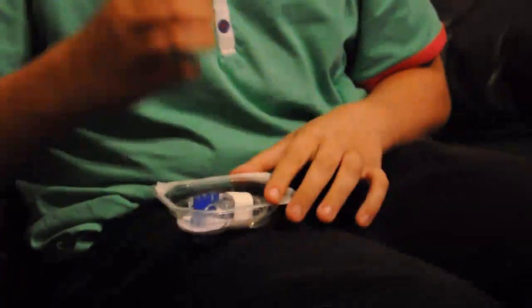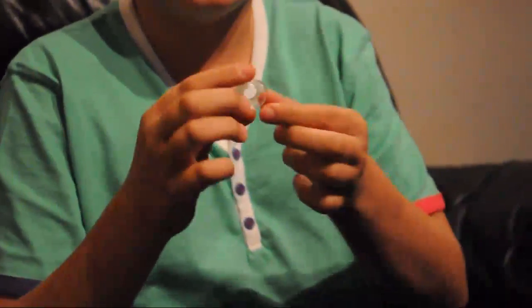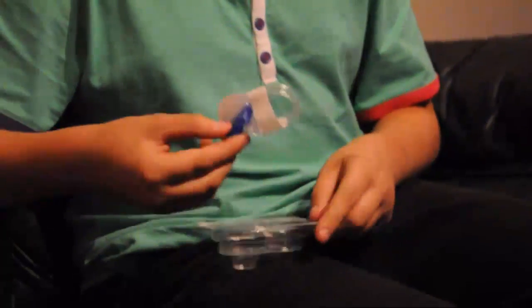Then you need to get your infusion set. You need to peel the back off. And then there's a little cap inside it. This is just for if you do any exercise, if you go swimming or anything. You just put that straight on the top like that and twist like I did before, just to make sure that it's not rough and you don't catch it. And then there's a little tab, just pull the tab back so that it's all loose.